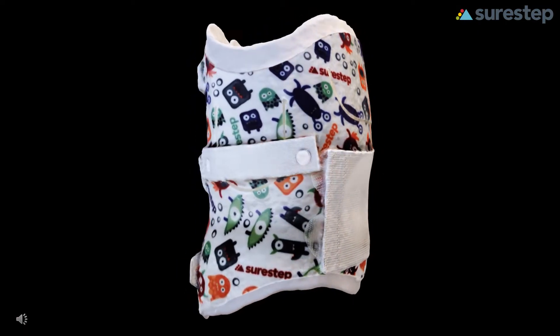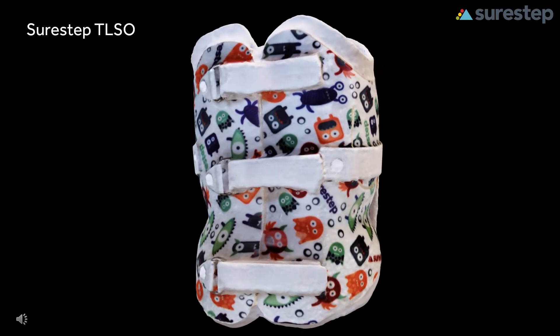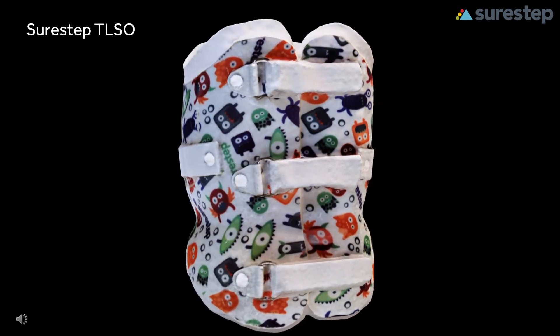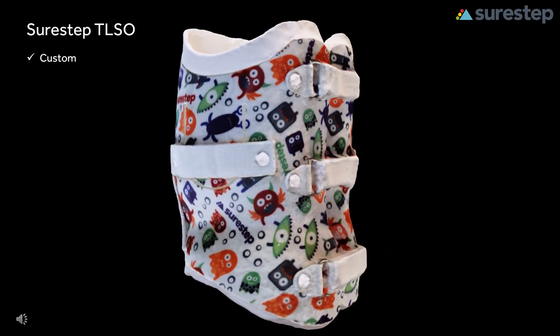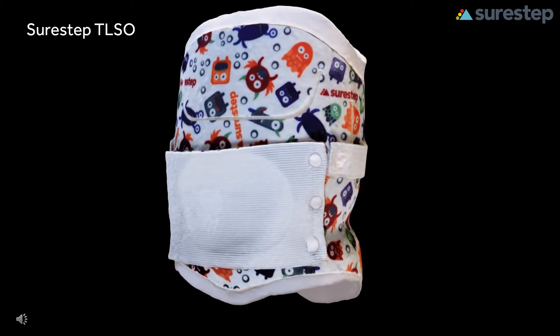If you answered yes, then the SureStep TLSO is a solution you have been looking for. The SureStep TLSO is a custom TLSO for patients with poor trunk posture or neuromuscular scoliosis due to hypotonia or hypertonia.